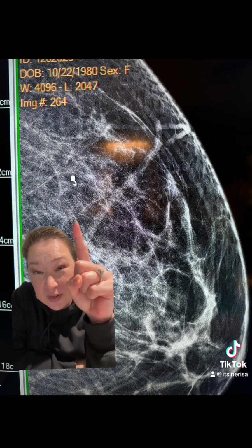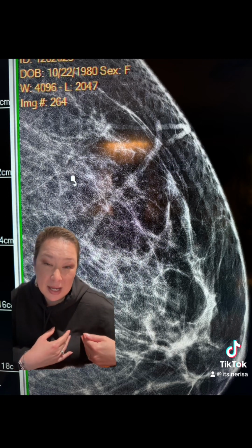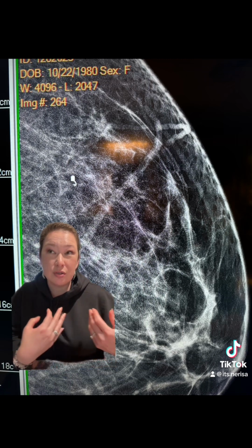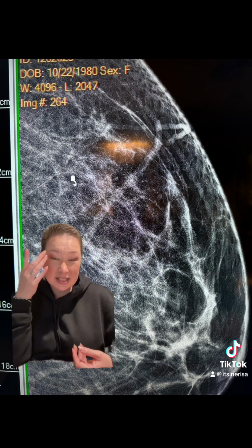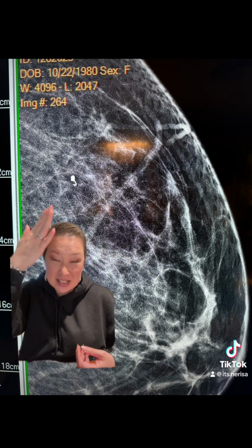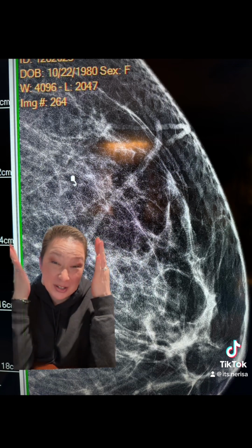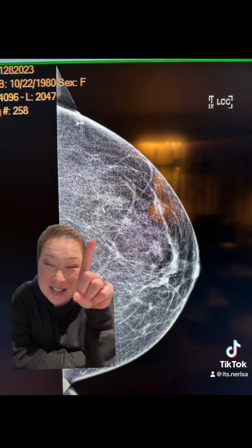There we go. That little dot right there is a titanium marker, and they do that during your biopsy procedure to mark where your suspicious spot is, so that they can track it. If anything happens later on, they know exactly where to look, or to mark off that they've already confirmed that it wasn't cancerous. And in my case, my cancer was eliminated by the chemo, and as you can see, around it is fairly clear. So this tells them where my cancer was, and the only thing left is the marker. Another picture of my boob without cancer.